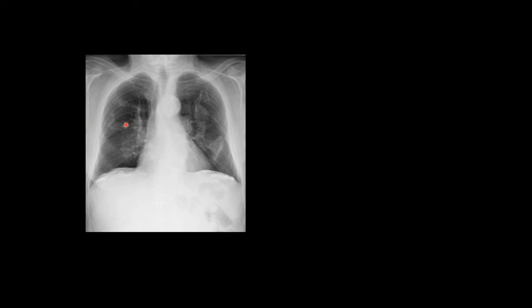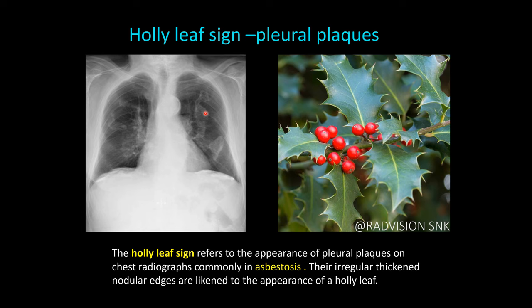You can also see there is curvilinear calcification along the diaphragmatic margins, typically involving the medial two-thirds and sparing the lateral one-third. This is a classical case of asbestosis. These are calcified pleural plaques which mimic holly leaves — this is called the holly leaf sign, typically seen in asbestosis.